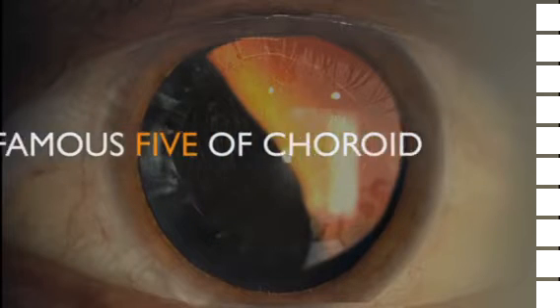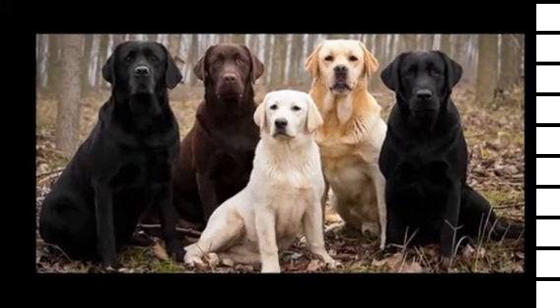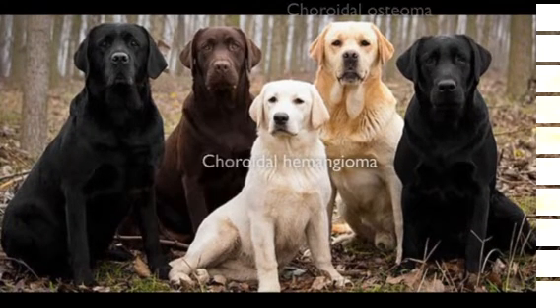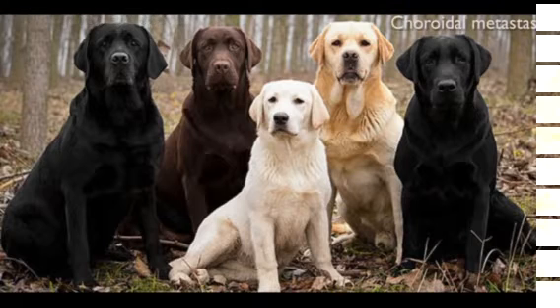The famous 5 of choroid. In this video, we demonstrate the ophthalmoscopic and imaging characteristics of choroidal hemangioma, osteoma, granuloma, melanoma, and choroidal metastasis.